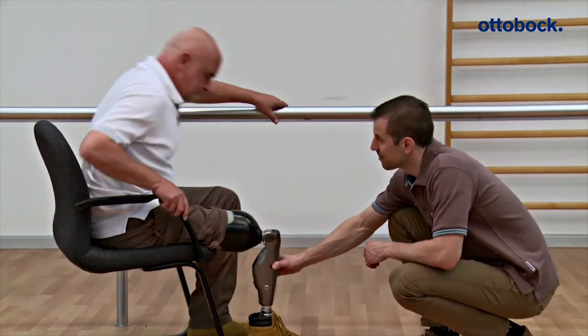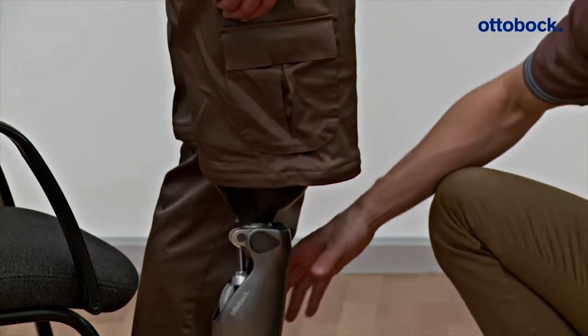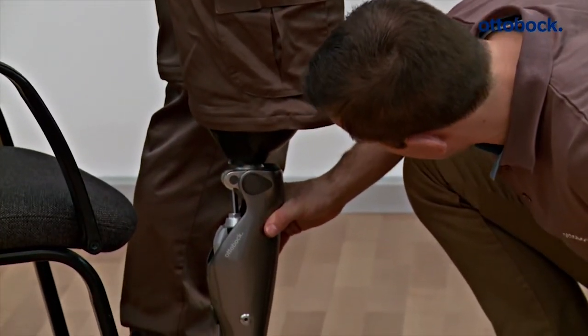Finally, the constructed prosthesis is checked once more on the user for sufficient distance under a load in a static situation.